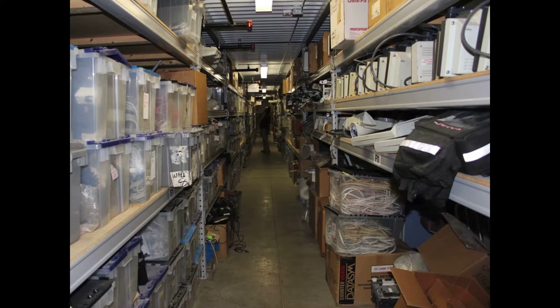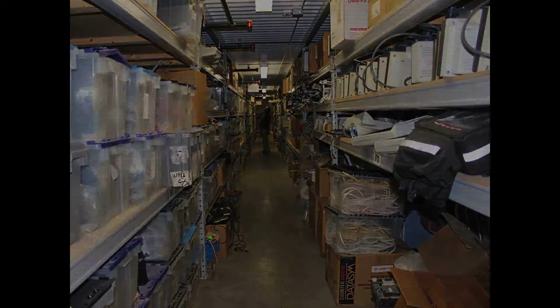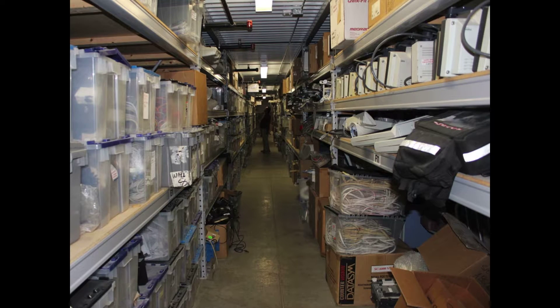We have one of the largest inventories of parts and equipment in the industry. This allows us to quickly repair and return units back to specifications.